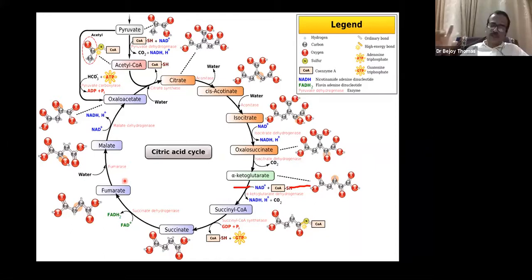So that's what I told. The radiologist should be seeing the case, should place the voxels correctly, and should decide which TE spectroscopy has to be done. When two TE spectroscopy has to be done, it has to be done. You cannot call the patient back later, because the patient will already have received antibiotics by that time.